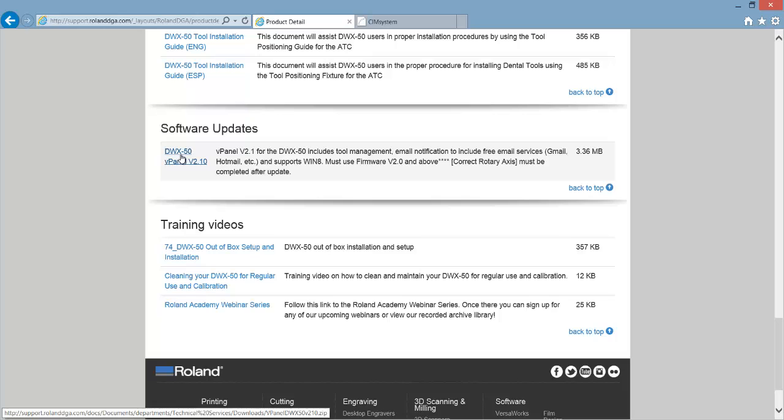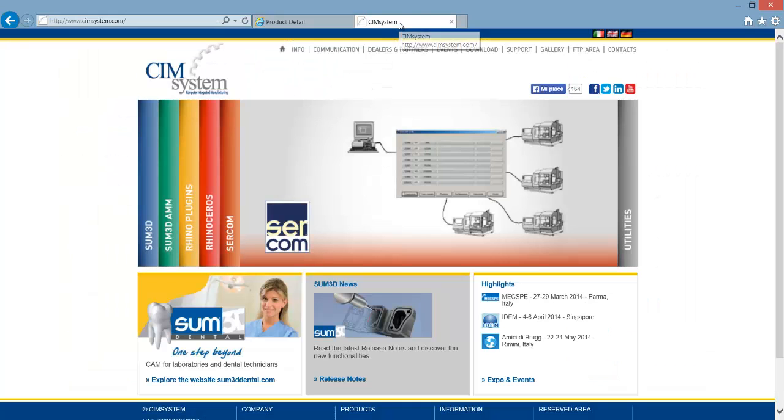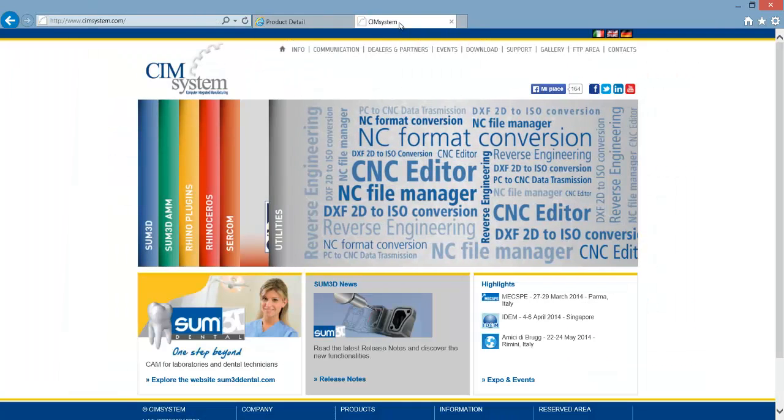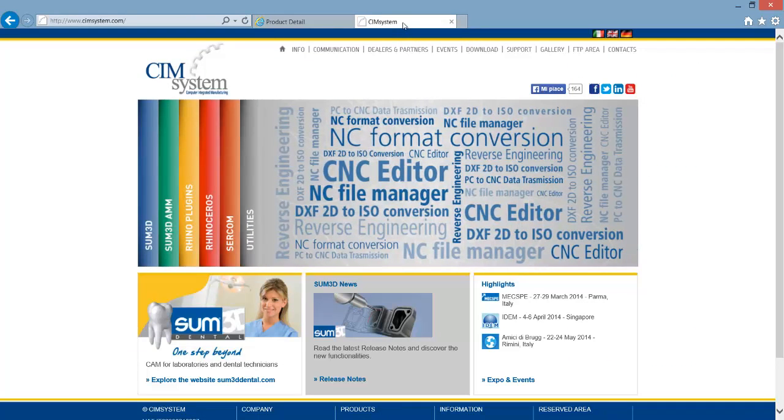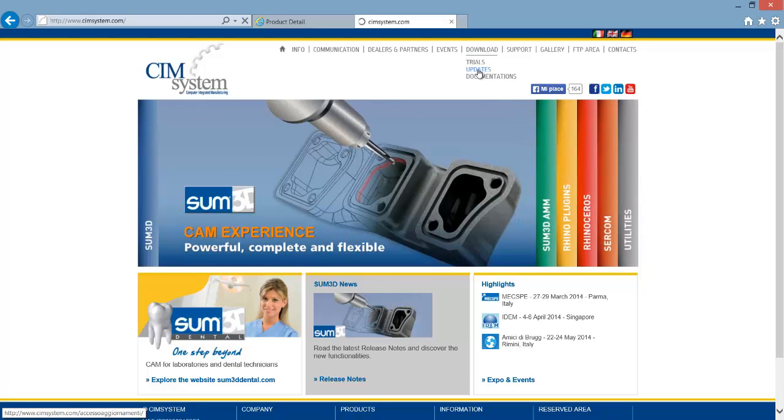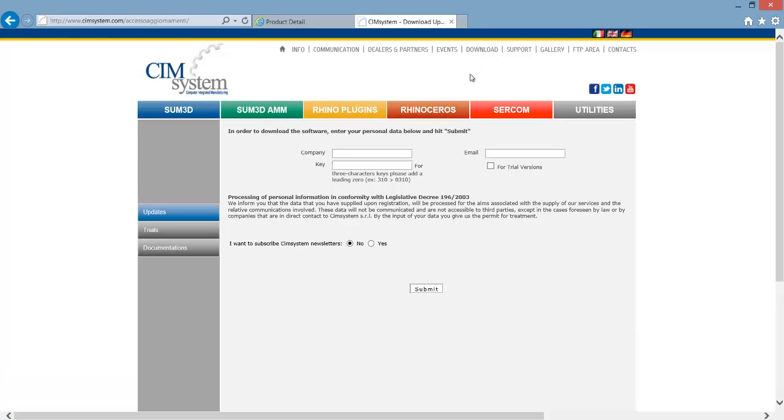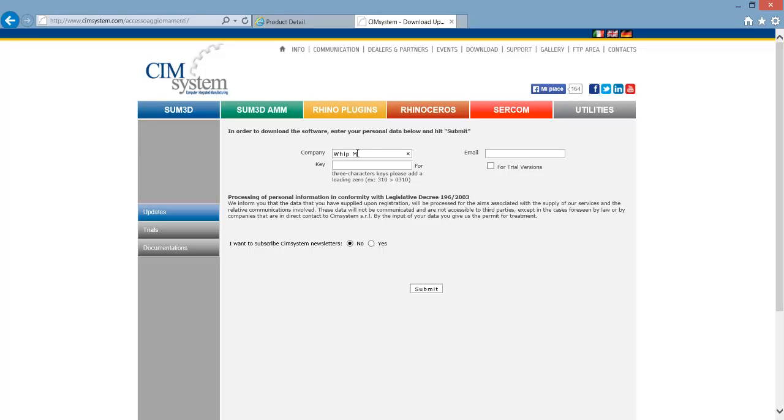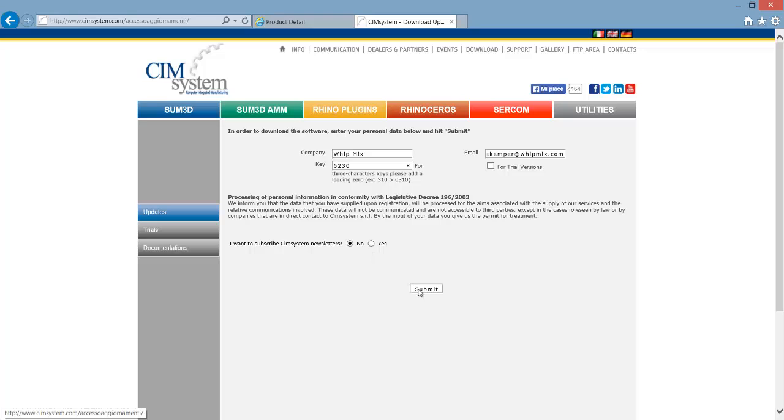Once you have the three different software updates from Roland, open another tab and go to simsystem.com. When this page loads click download and then updates. Here type in your company name, an email, and your dongle number. Click submit.